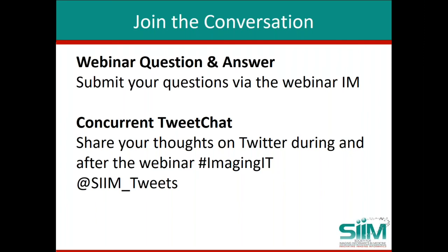Frederick? Well, Orthanc is completely Dockerized, so you can use any instance of Orthanc for a specific purpose, and it can thus be used as a microservice, which comes in very handy when you just want to use Orthanc for a specific feature. So yes, it is completely Dockerized. And Judy? Yes, LibreHealth RIS is completely Dockerized. If you just go to the repo on GitLab right now, that's what you're using. You can just set up with like two commands and you're up and running.